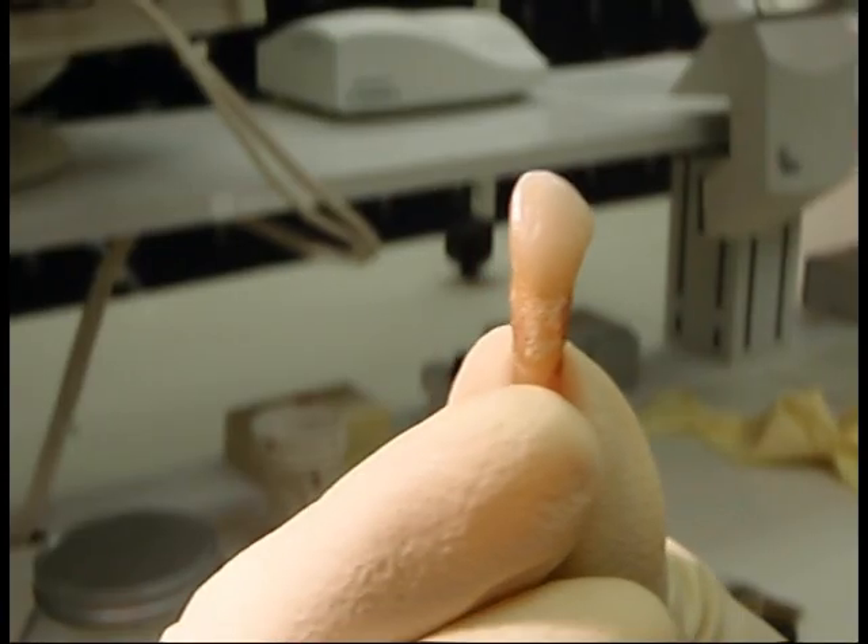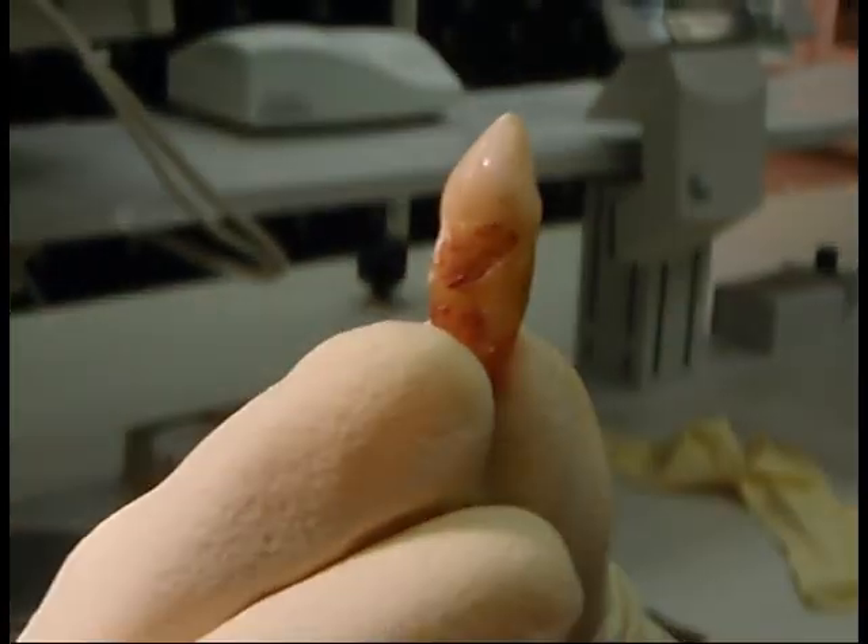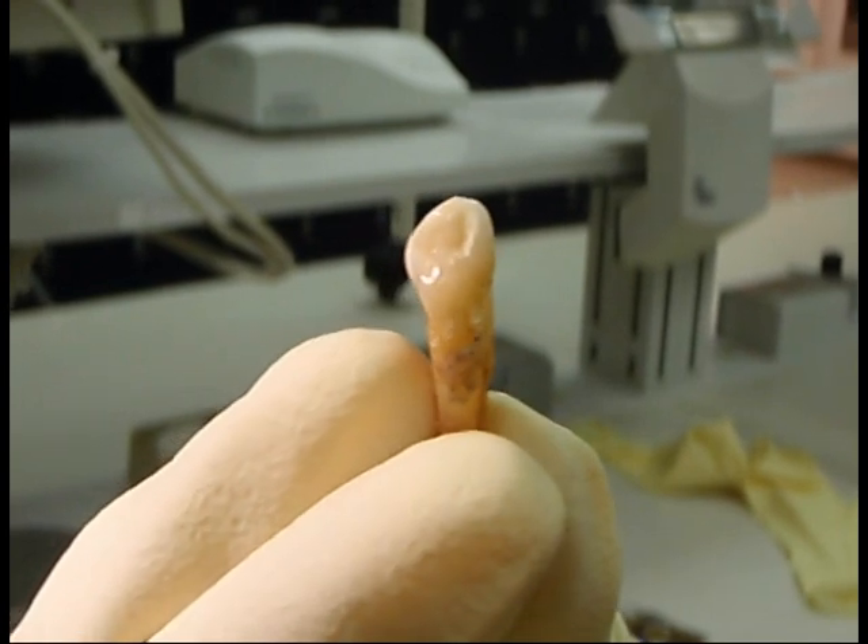This video will illustrate the steps required to access and shape the root canals of a handheld mandibular canine.